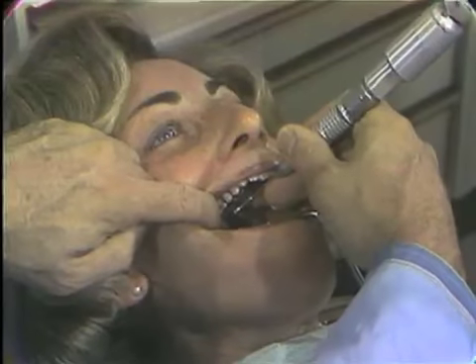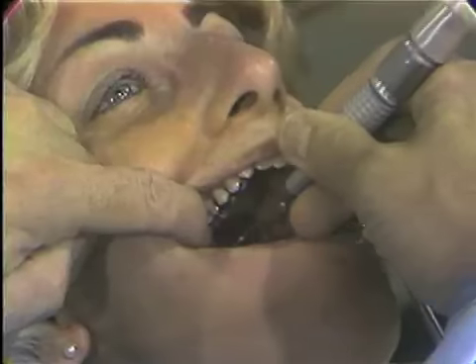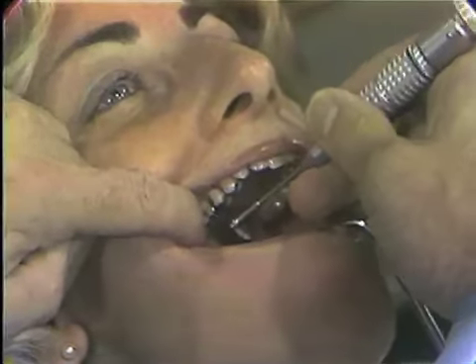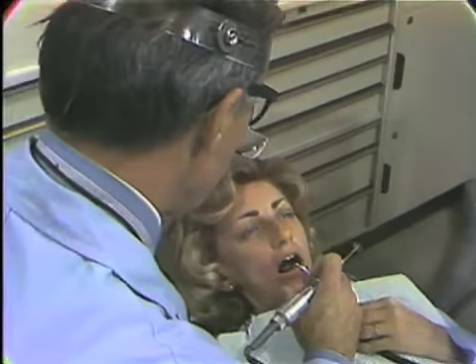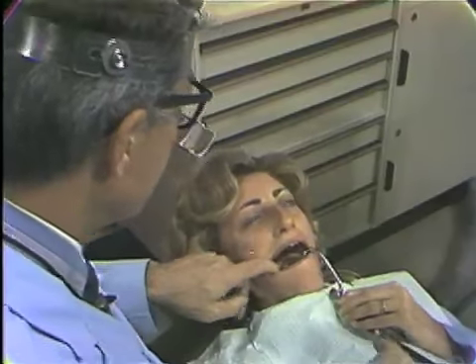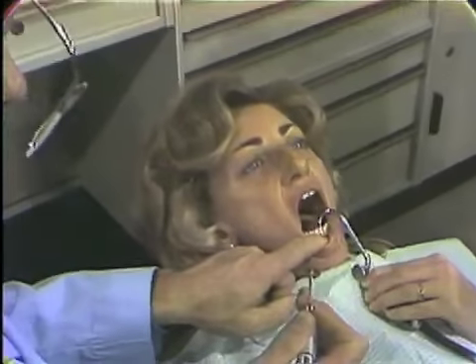Without that mandrel, we would have to be putting a terrific taper to get beyond the head of this handpiece, as you can see where my thumb is. So that is the purpose of the long mandrel. Now if we're slicing on the lower right, we will just move the patient back slightly and tilt their head down a little bit so that the jaw is practically parallel with the floor when they are in the position for you to work. Pull the lip back with your finger.